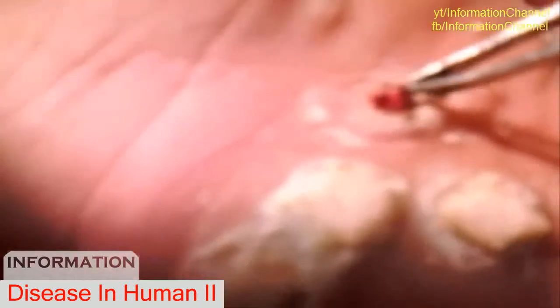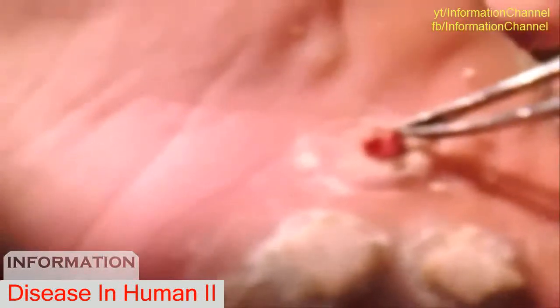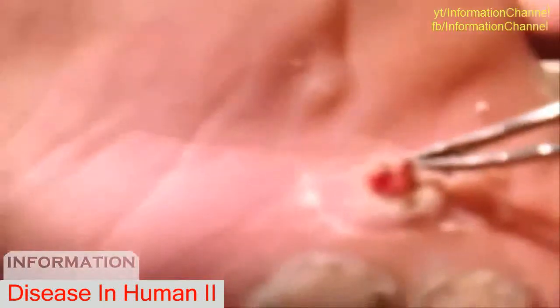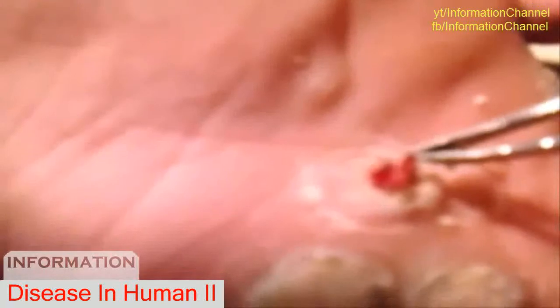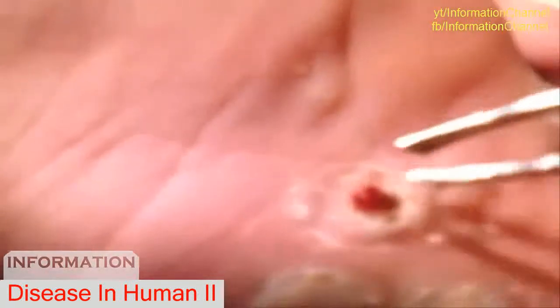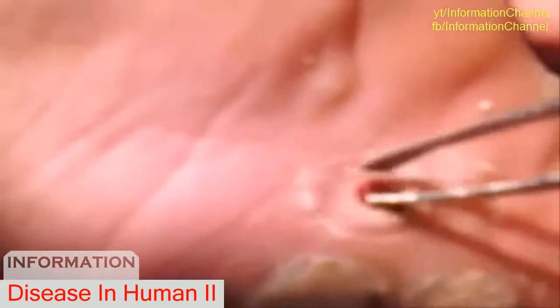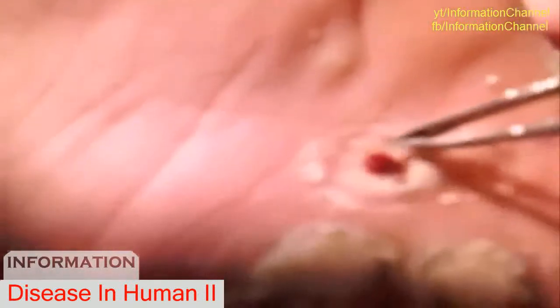Ow. Oh my God. You can hear yourself on that mic. Ow. Jeez. Come on. Oh my God. See how it looks right there? The little thing in the middle. It's going to go as deep now.